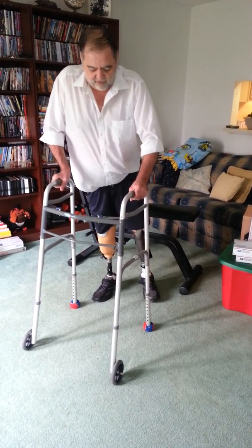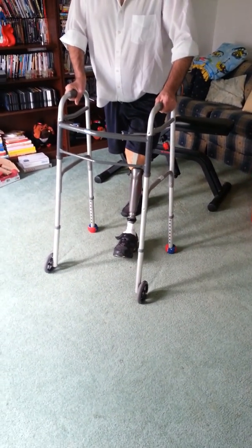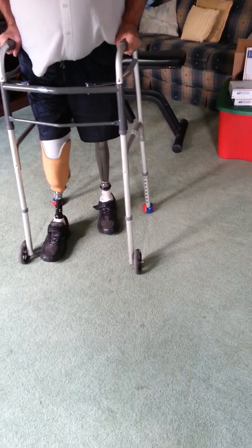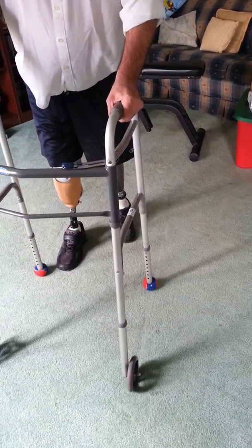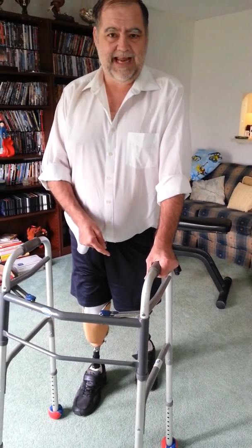So heel to toe, of course, makes sense, which, you know, you want to come out and you want to do the heel, crush the bug, and then you come forward and swing through. Of course, you're on parallel bars, so that makes a difference. And heel to toe made sense to me. The part that didn't make sense to me was how to lock this knee.